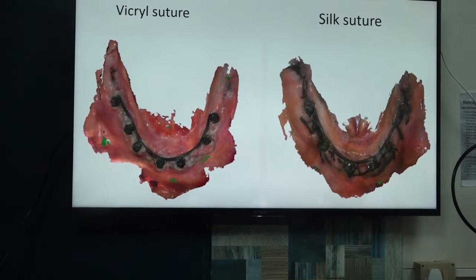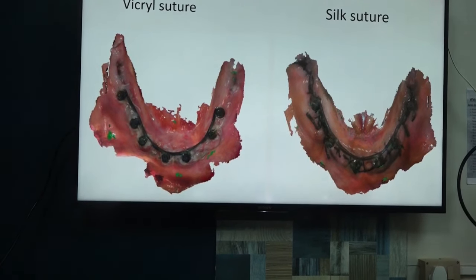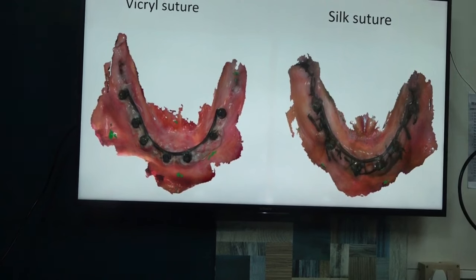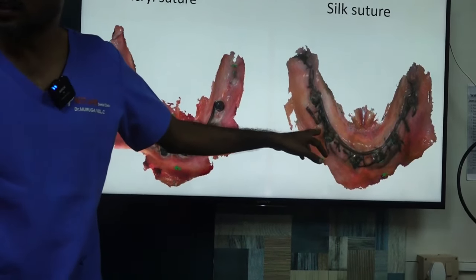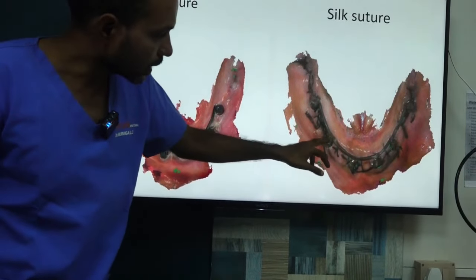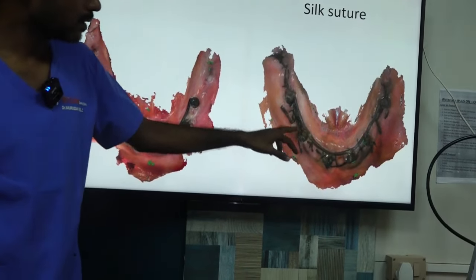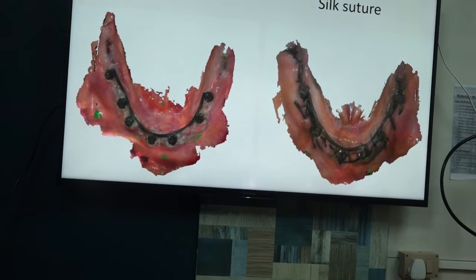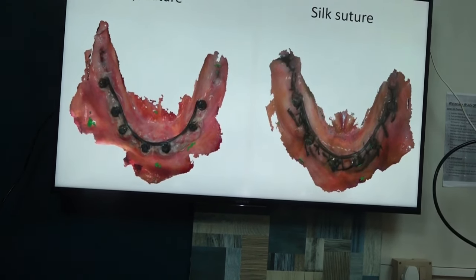When it comes to the digital protocol, the plus is you can use the silk as a landmark, right? But if it is moving, then you cannot use it. You can select the immovable part, not the free end. Okay, there is something called merging of upper and lower scans.